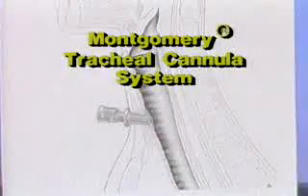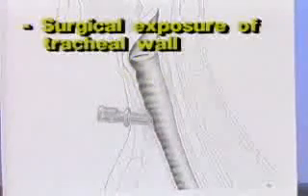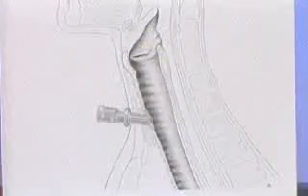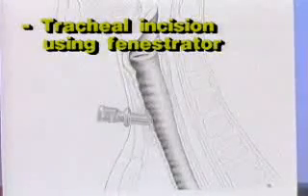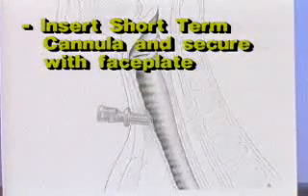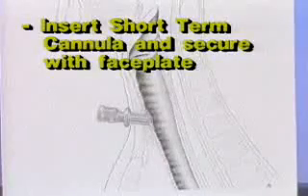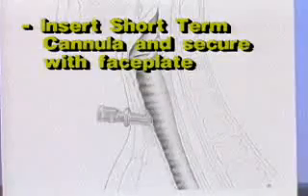To summarize the procedure for the Montgomery tracheal cannula system. First, surgically expose the tracheal wall, preferably using a vertical incision. Create a circular incision using the Montgomery tracheal fenestrator. Insert the short-term cannula using curved hemostats into the trachea. The 27-degree angle of the flange will seat nicely against the anterior tracheal wall. If necessary, use the faceplate to secure the cannula in place.